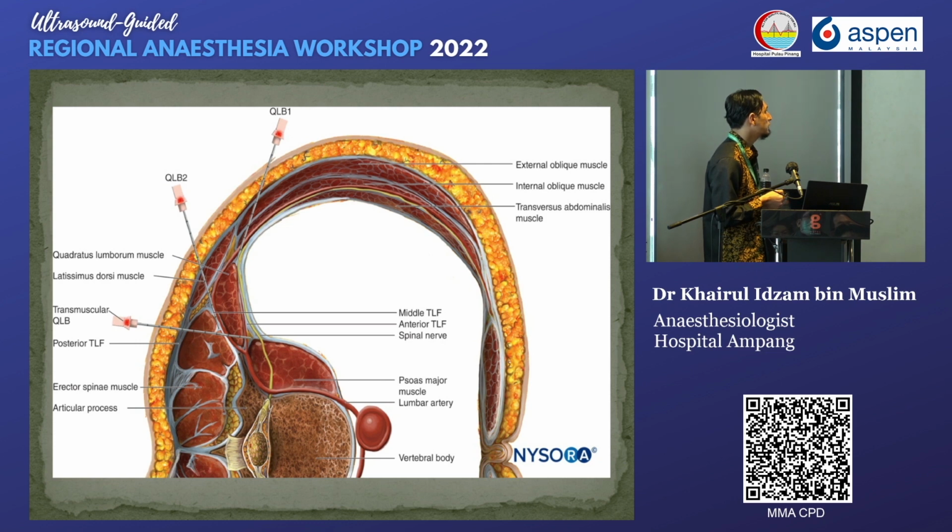For QL1, we inject between the QL muscle and the end of the transversus abdominis muscle.